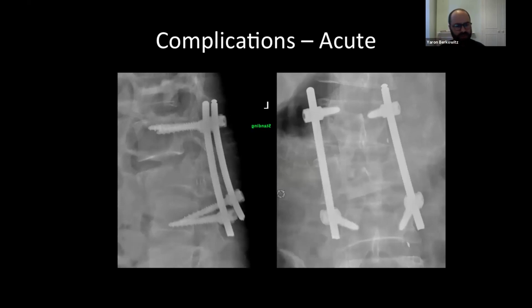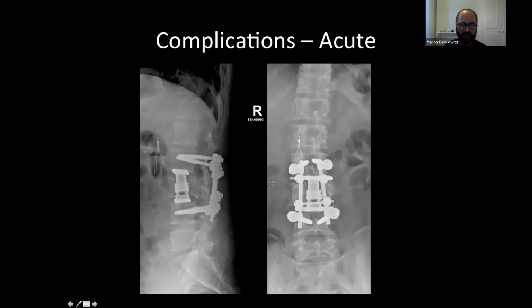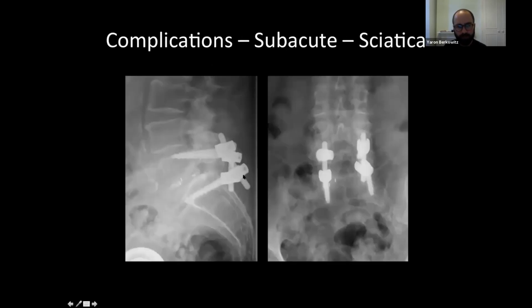So as the patient stood up, they collapsed down because the rod's basically just bent, or the screws might have pulled out slightly. And they had more definitive fixation with the cage holding things up. This patient presented subacutely. So the complication was at the time of surgery, but they presented subacutely. They did radiographs and checked that this is an L5-S1 fixation.